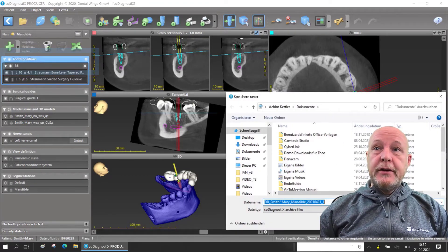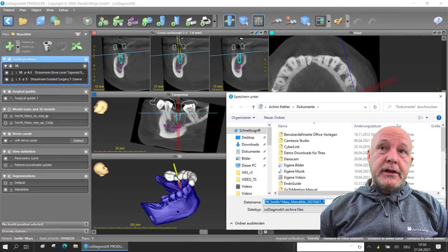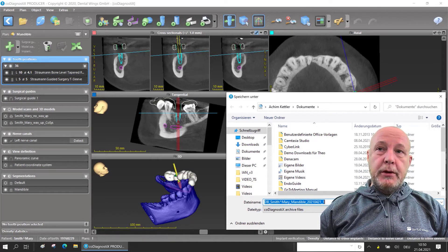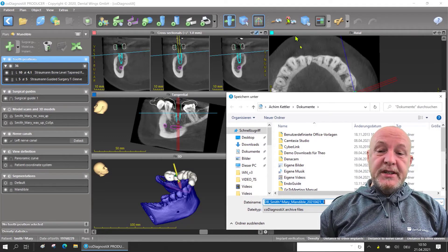You will see the filename; decide where you want to save it, for example on the desktop or on the USB stick.